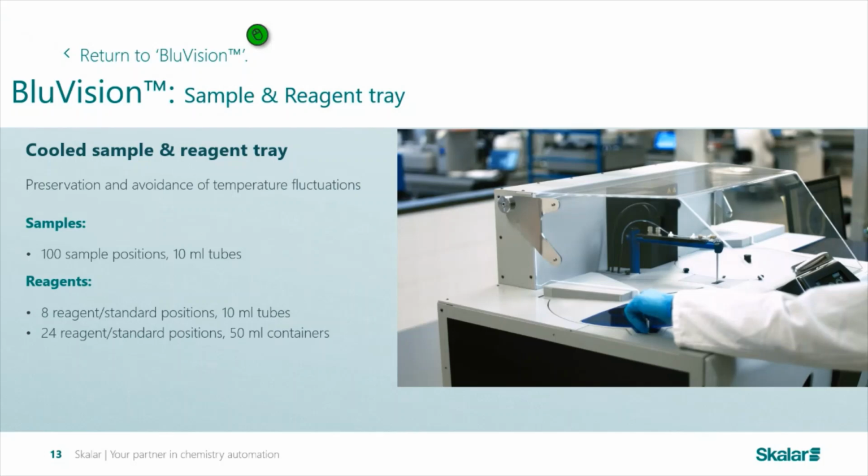But what this does for the lab is place less demands on the location of the analyzer in the lab, because any fluctuations in the temperature of the laboratory cannot affect the samples or the reagents, and therefore don't impact on our analyses in any way.